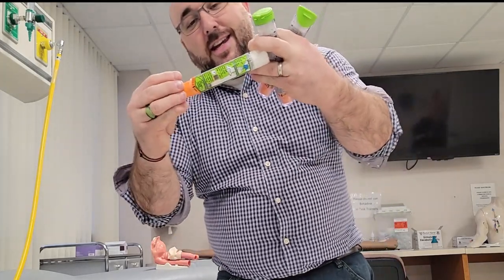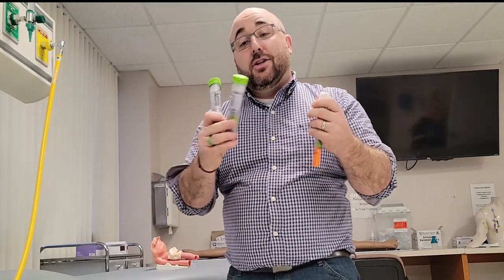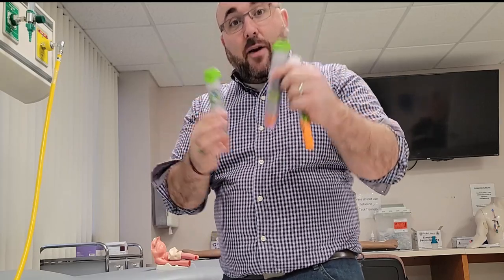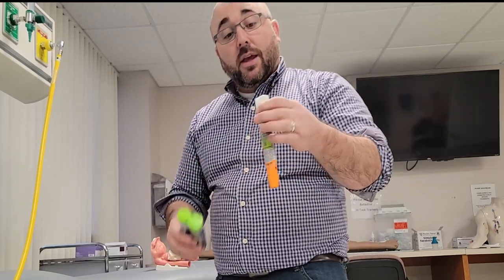I've got three of them here. Obviously this is the trainer — this needle doesn't even go in. These are EpiPen Juniors and they're actually extremely expired, probably like 2011 on both of them, but they do have epinephrine in them. So I'll be playing carefully with these today because I don't want to get amped up even more and end up in the ER.